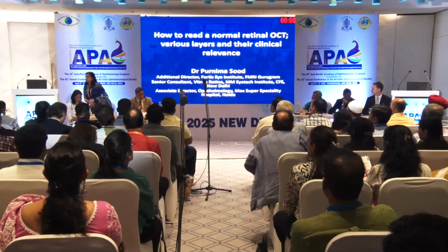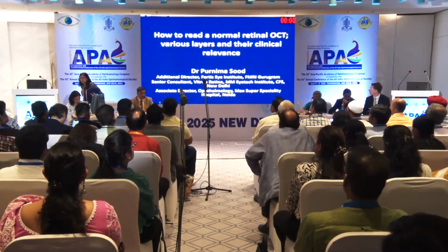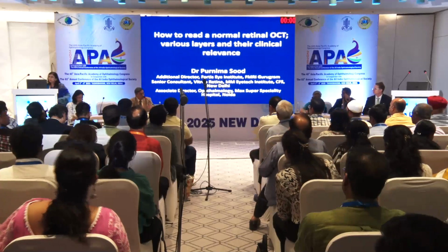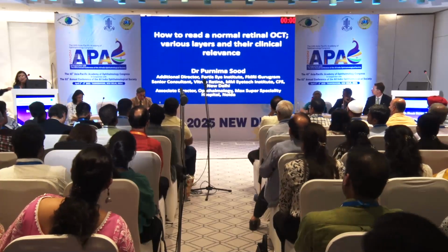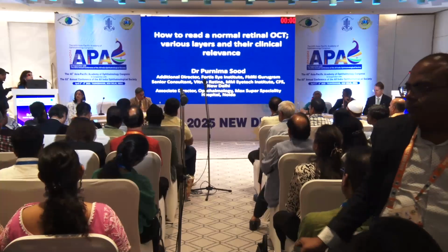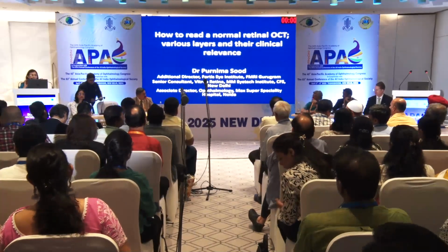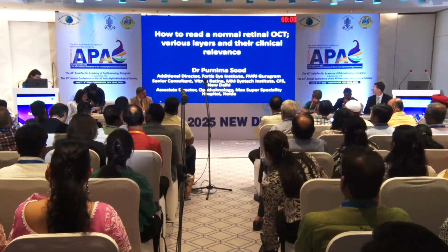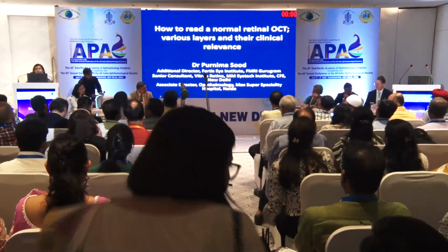Thank you. Okay, so we'll now have Dr. Purnima Sood, who's going to tell us how to read the normal retinal OCT, various layers, and their clinical significance. After she's done that, we will talk about the pathological changes of the OCT in various retinal disorders. And finally, we will conclude with the newer things which we can learn from OCT, including OCT angiography, which Dr. Naresh Yadav will tell us.